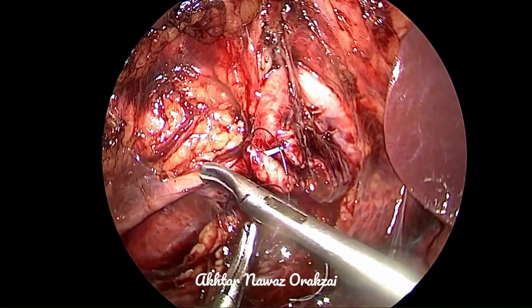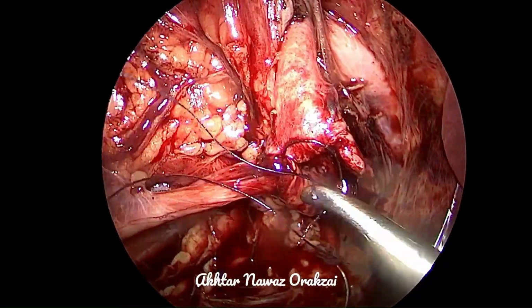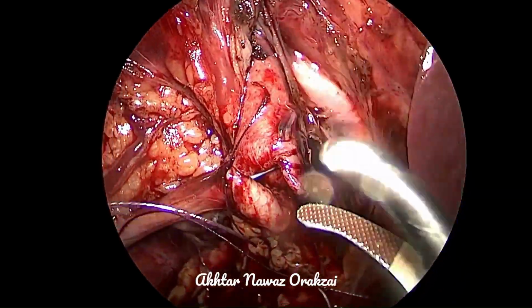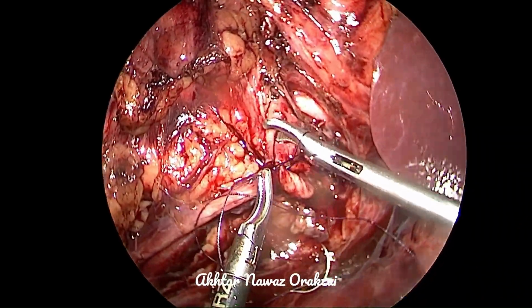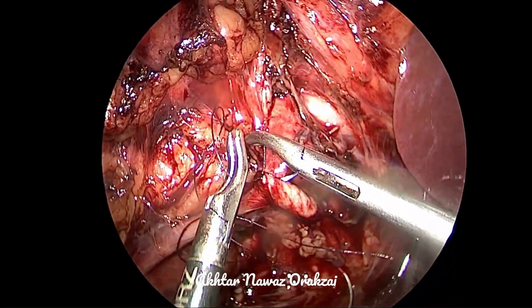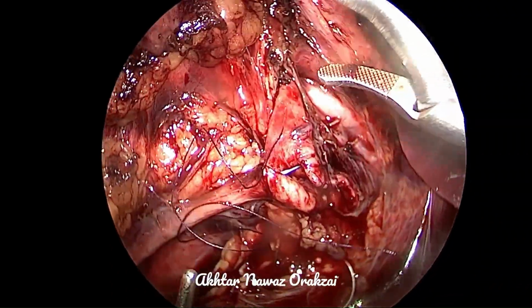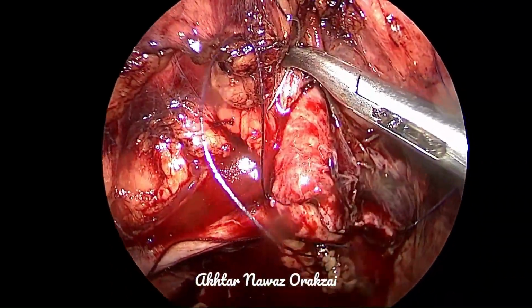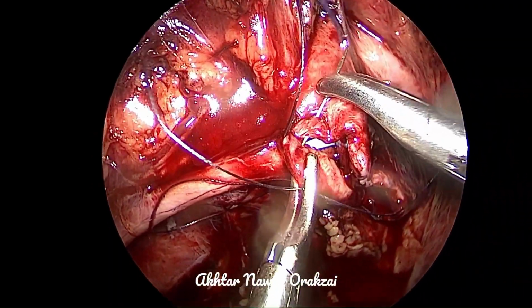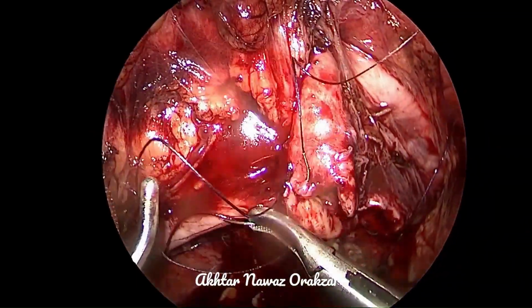You can make a C and then place the needle holder in the center of this C, and then you make a knot, then another C, another knot. This first stitch is usually important and is also difficult. Once this first knot is taken, the rest of the job becomes easy. Care must be taken not to take the stent in the stitch.